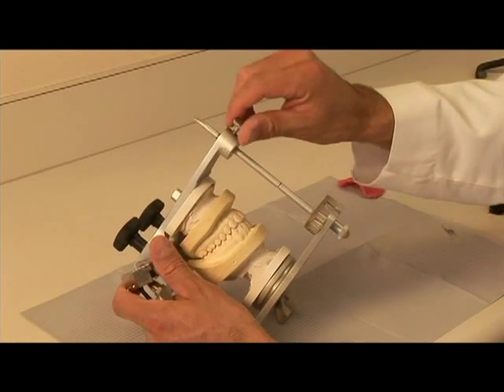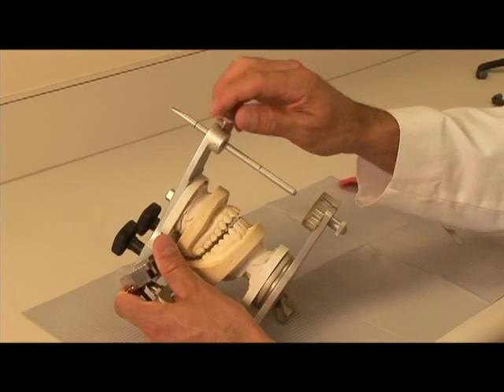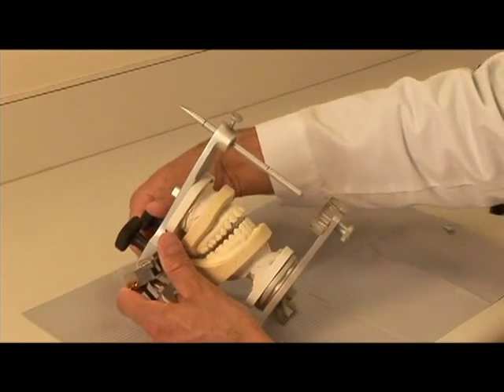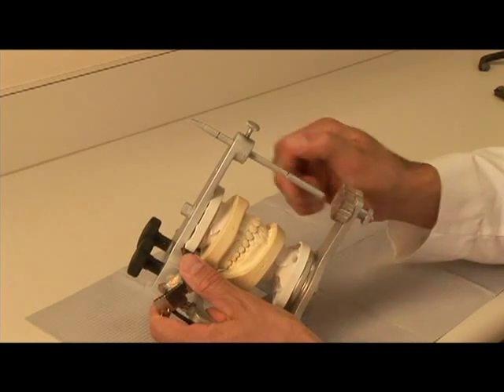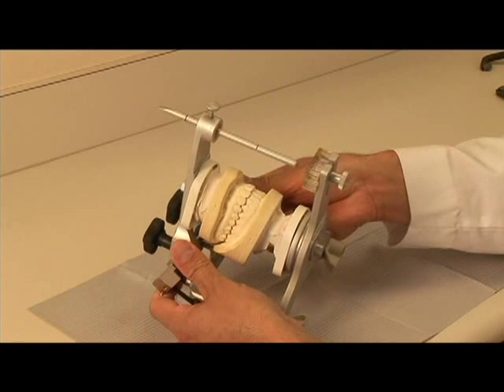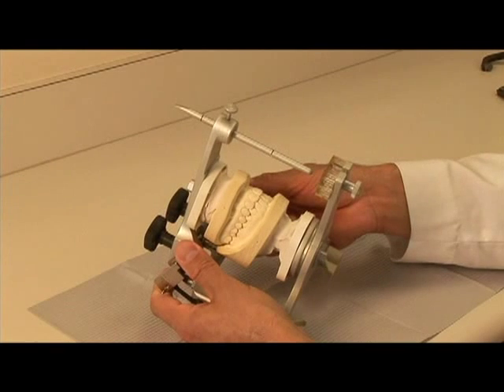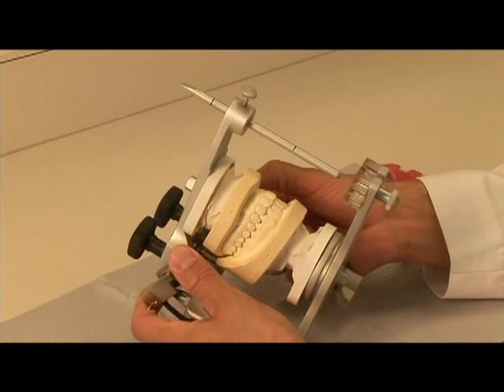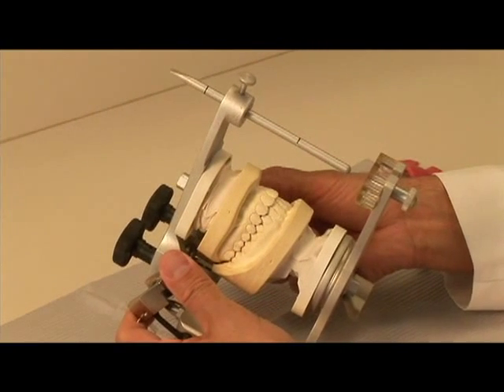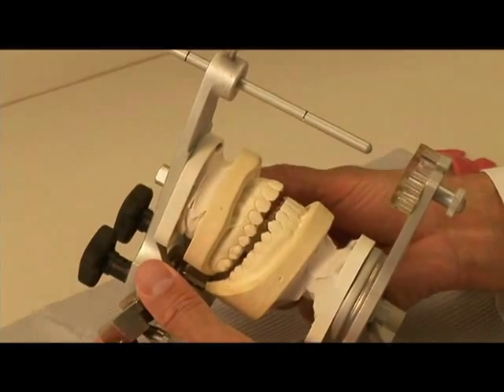To do this, loosen the incisal guide pin screw, raise the pin, and temporarily retighten the screw. Unlock the centric latch, close the articulator to the first point of contact, making sure that the condylar elements are seated, and then close to the maximum intercuspal position. Watch for any sliding movement. The same slide that was produced in the patient clinically should be reproduced on the articulator if present.